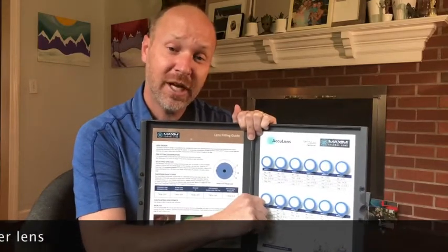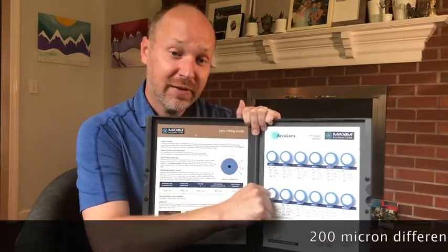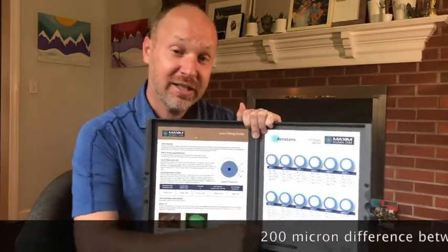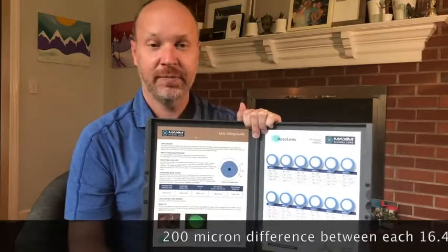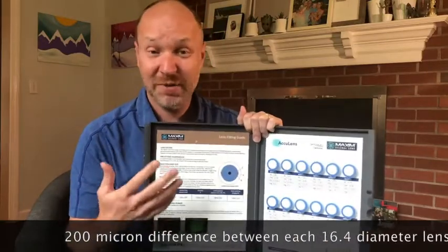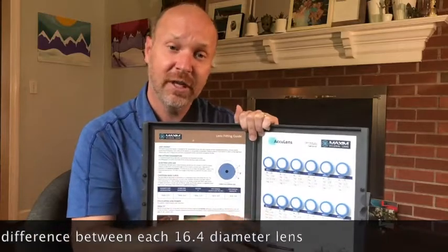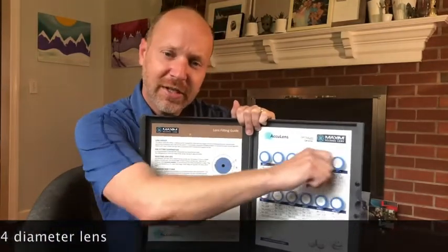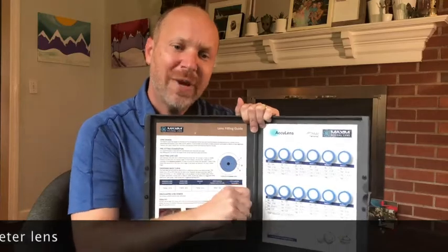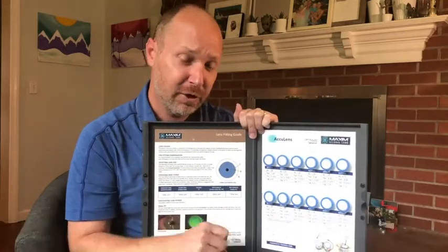On the larger lenses — they're 16.4 diameter — they have a larger back optic zone and wider cord length. Therefore, when we change the curvature on these lenses, the difference between each lens is about 200 microns. If you want to keep it simple, think of each lens as about 200 microns difference. Or, to be a little more specific: about 150 microns on the 15.9 row, and about 200 microns between each lens on the 16.4 row.